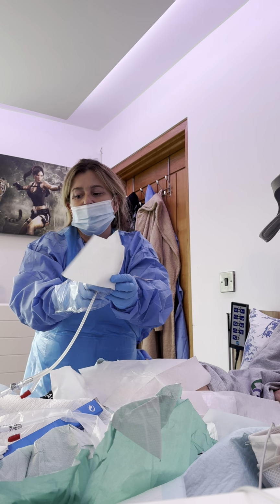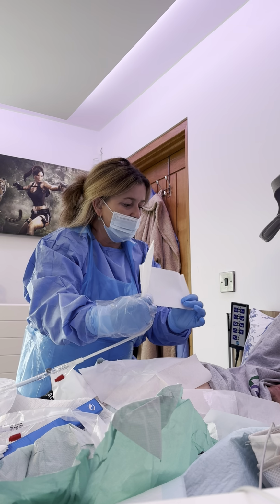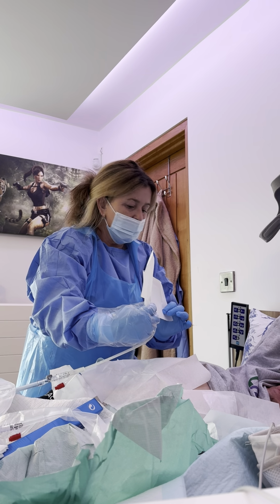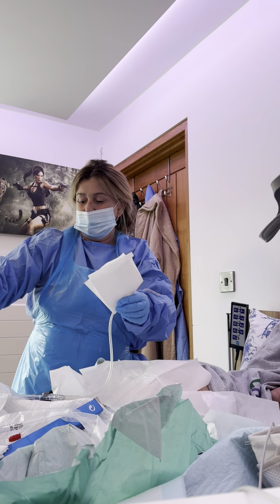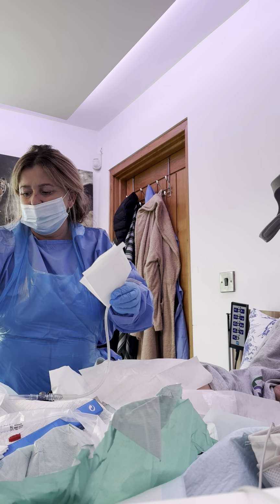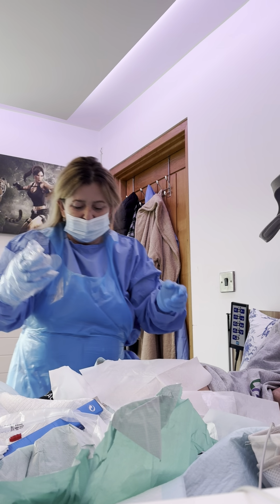So I'll re-blow that in a second, and I'll show Ben, because he always likes to see what he's got. Can you see that? It's not blood. That is infection. So if I took my mask off right now, my nose can smell it. I'm going to put that to one side, and I'll show you once I've got the new catheter in.